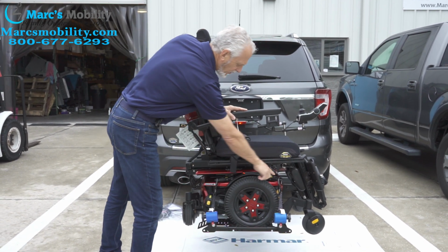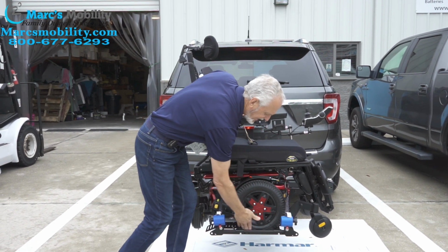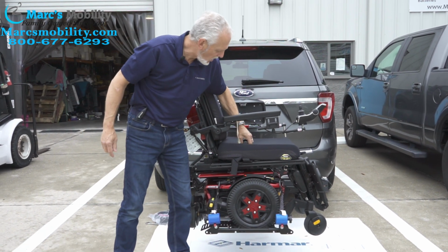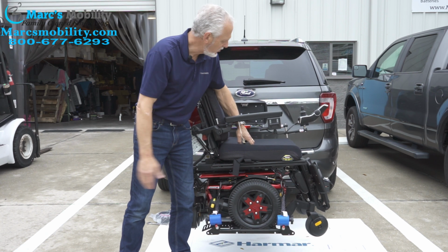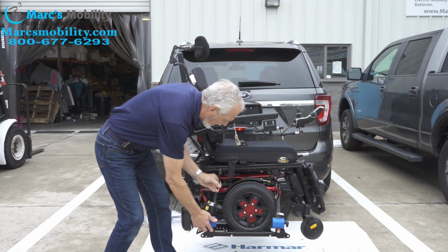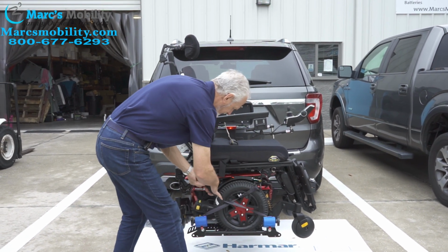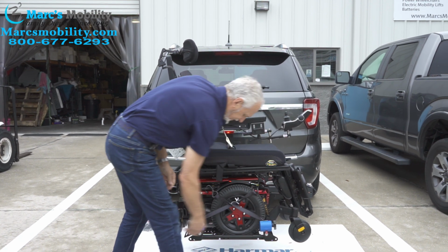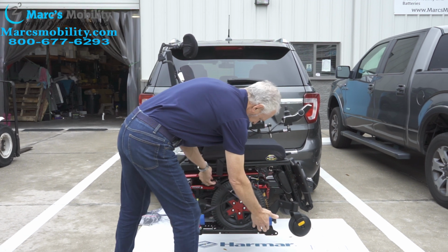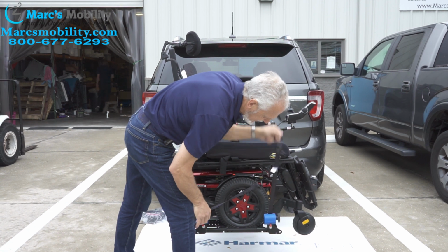So this chair has the anchor points. This chair is not going anywhere for two reasons. The wheels are stuck in here. You have the 4 straps holding the chair up, and you have the bar on top of here, even giving you more support. So I've had some people take these straps and cross them, go here, and then go this way. It's entirely up to you if you want to do it that way. On this chair, it probably works just as good to go this way. And when you pull the straps out, there you go.